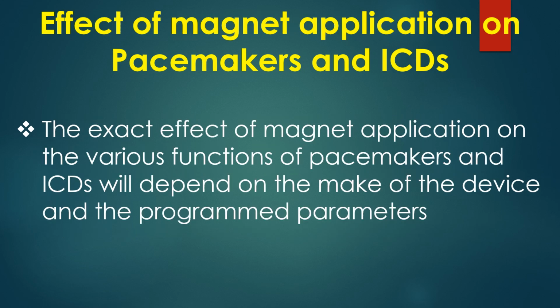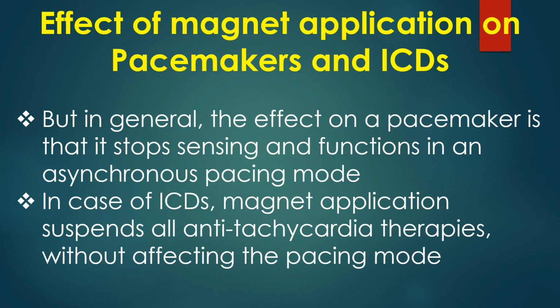The exact effect of magnet application on the various functions of pacemakers and ICDs will depend on the make of the device and the programmed parameters. But in general, the effect on pacemaker is that it stops sensing and functions in an asynchronous pacing mode. In case of ICDs, magnet application suspends all anti-tachycardia therapies without affecting the pacing mode.